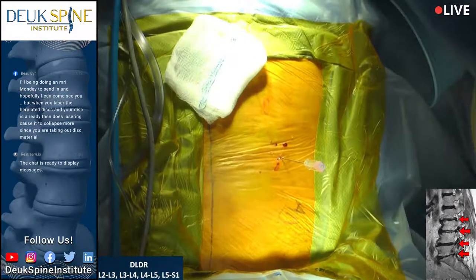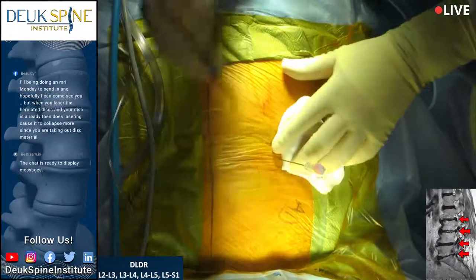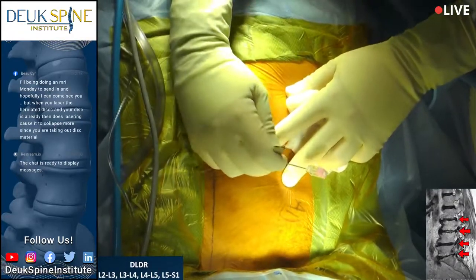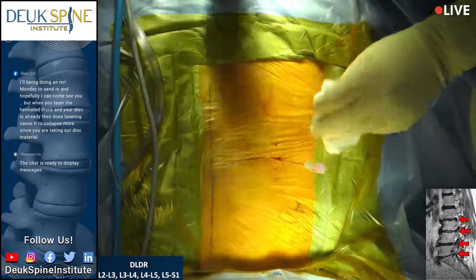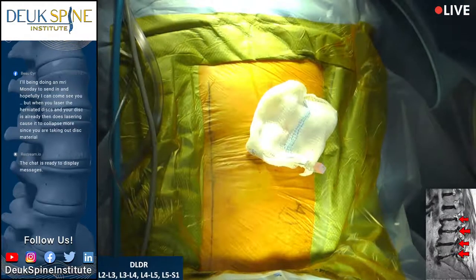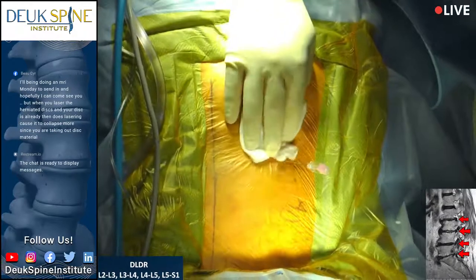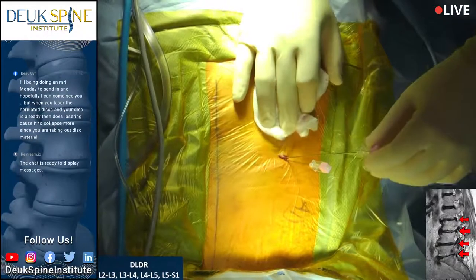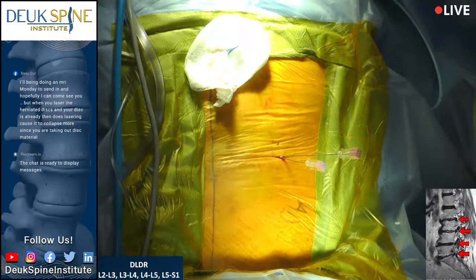All right, so I'm pretty happy at this point with L5-S1. When you watch this video and see what we're doing, don't be discouraged. This is a 10 out of 10 in terms of difficulty. And the truth is that I feel comfortable with what we're doing. But if you're just starting out doing endoscopic surgery, you won't be comfortable with a case like this. So you're going to have to start on much easier cases.